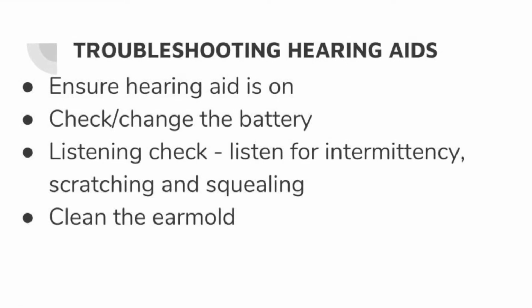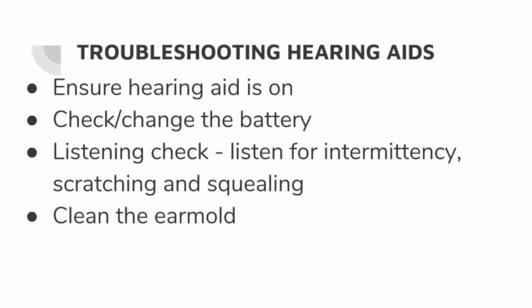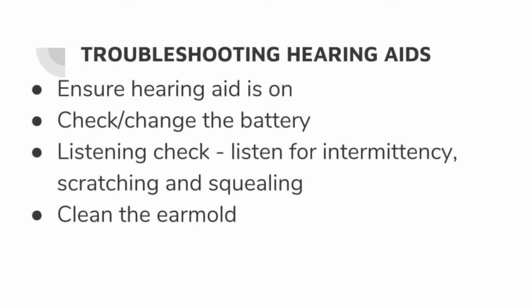And then there may be the possibility that you'll notice that there's some wax in the ear mold, or a lot of condensation or sweat in the ear mold. You may need to actually clean it or blow it dry. So these are some common things that teachers can do with a behind the ear hearing aid.